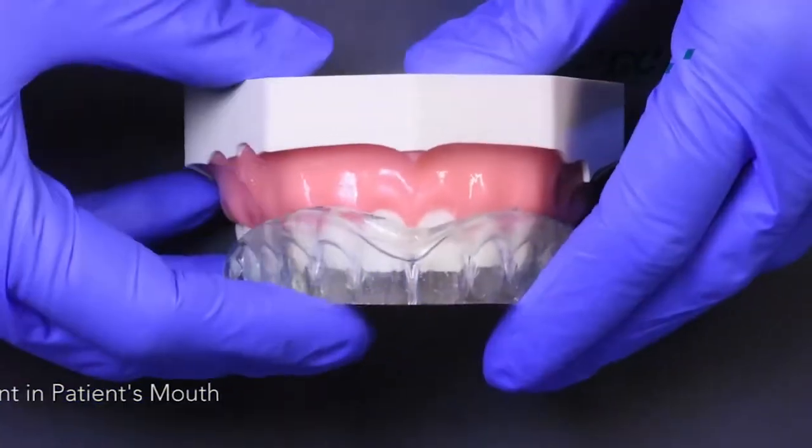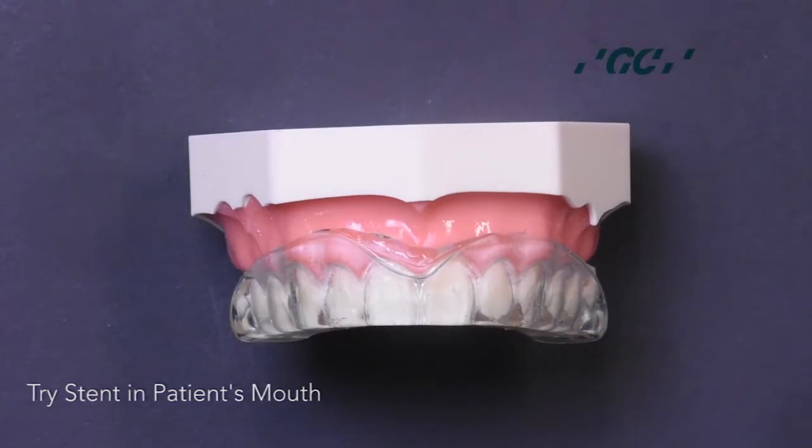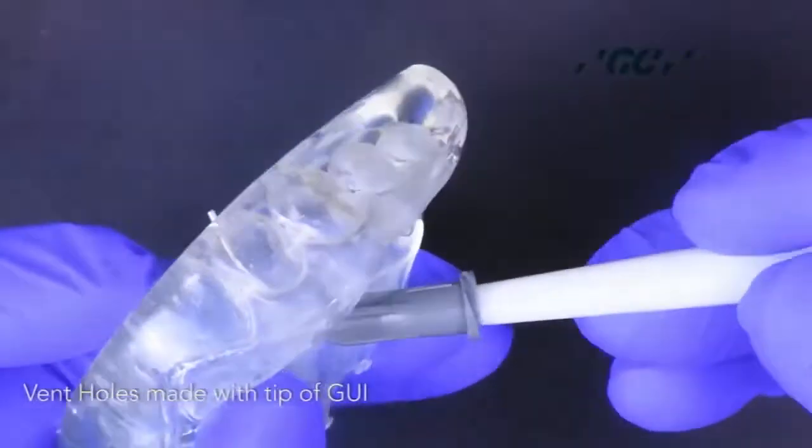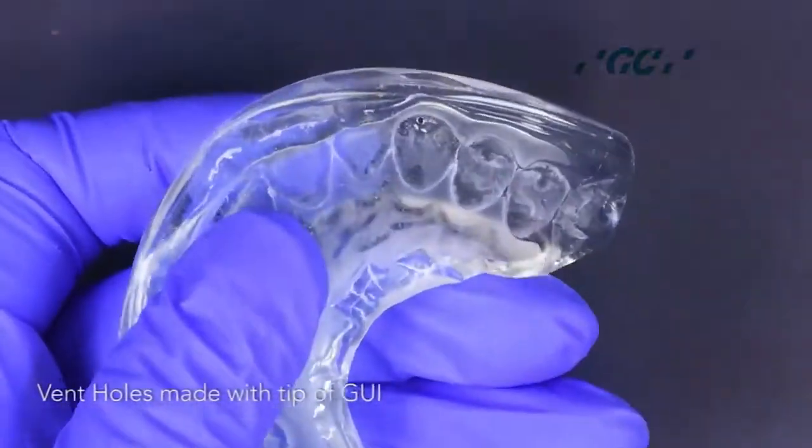The clear stent is checked for fit in the patient's mouth. Next, create vent holes in the stent with the tip of the Genial Universal injectable composite.